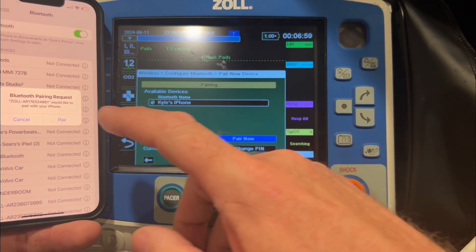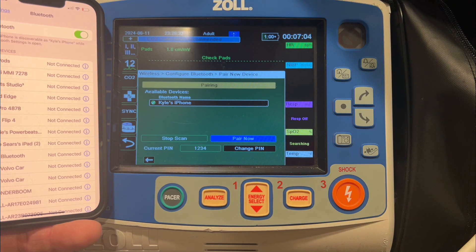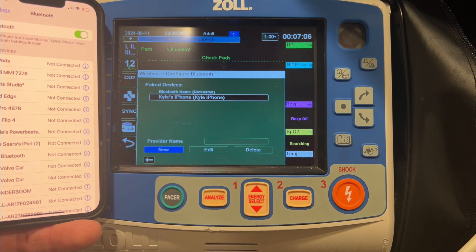On the phone itself, it's going to prompt you asking if you want to pair. Confirm that you do. It'll take a couple more seconds, and you'll see it connected. Now your paired devices include your phone.